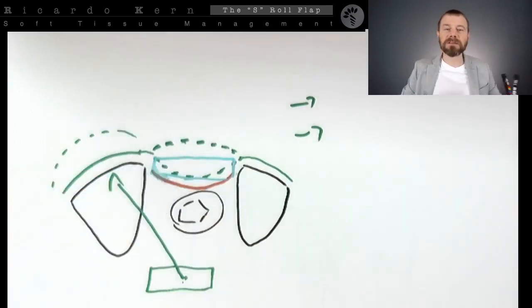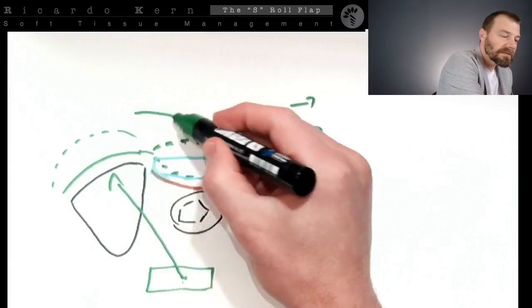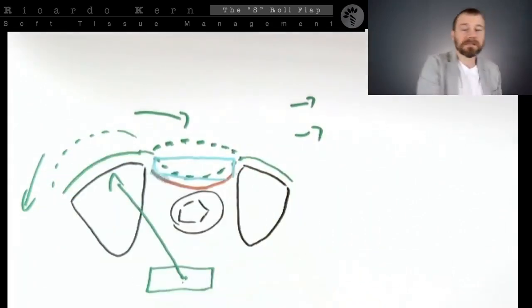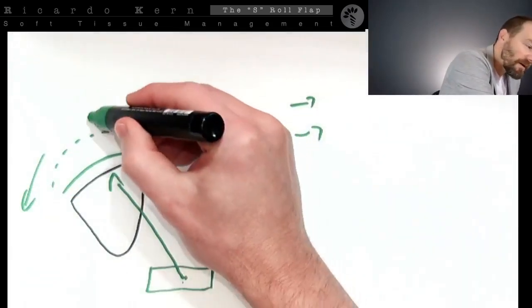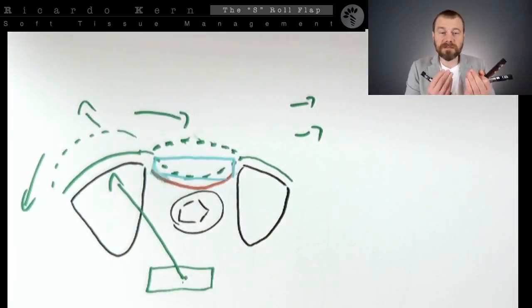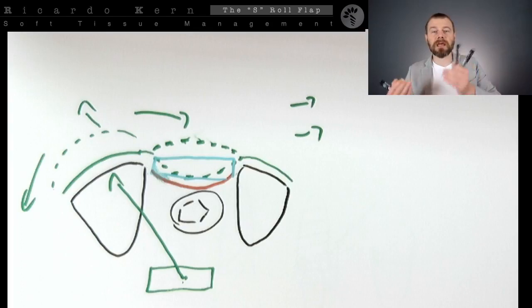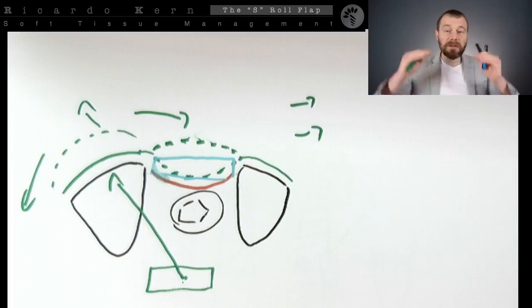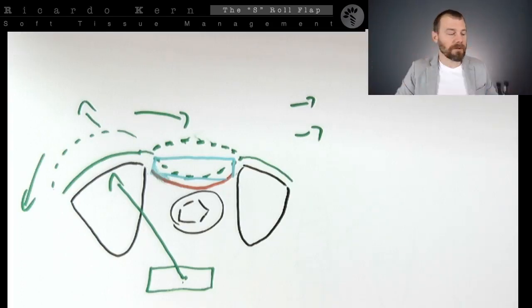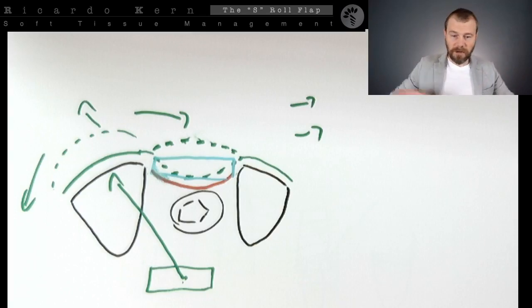It means that you need to release extra area. It means that you need to release from the lateral areas. It means that you need to release to the apical area, okay? That is why I told you in the beginning that just treating a color compromise area is the easiest approach, because the requirements in the preparation of the recipient area are simple. When you need to bring the tissue coronally, when you need to bring the tissue over the top of the crest, you're going to have more problems, so we're going to discuss that tomorrow, okay?